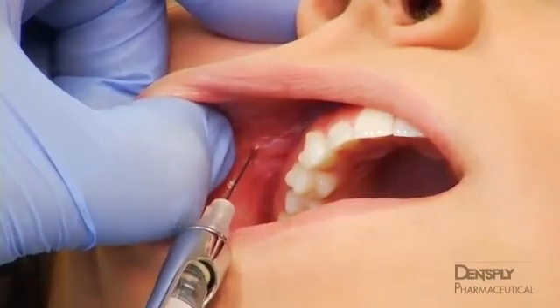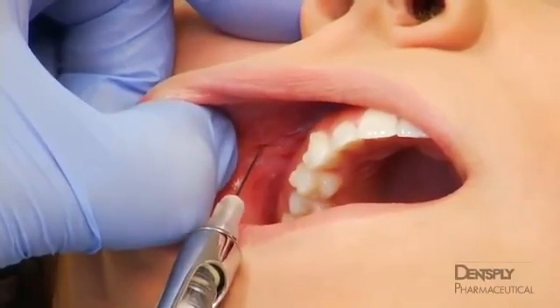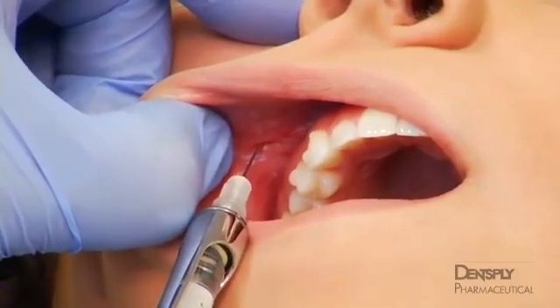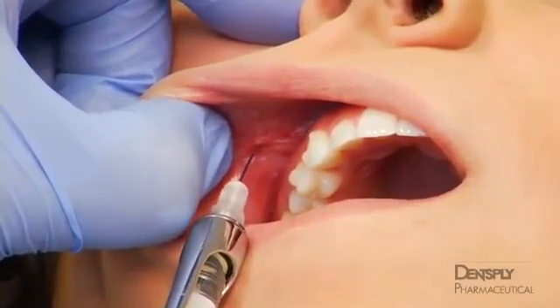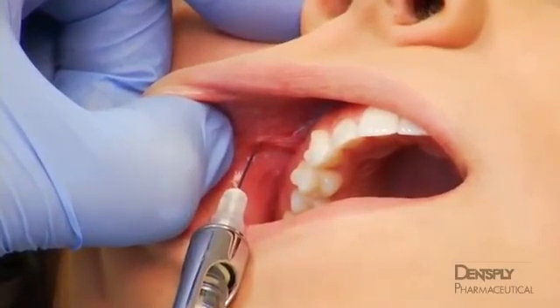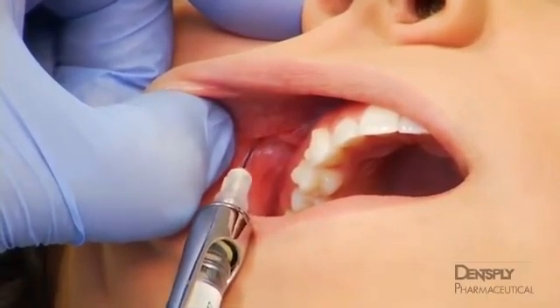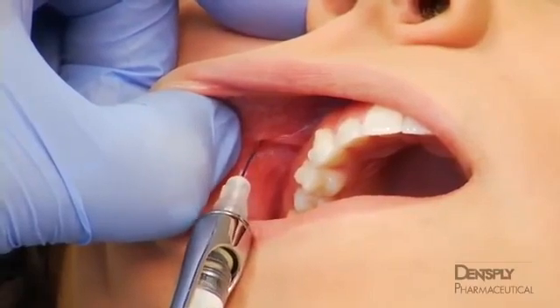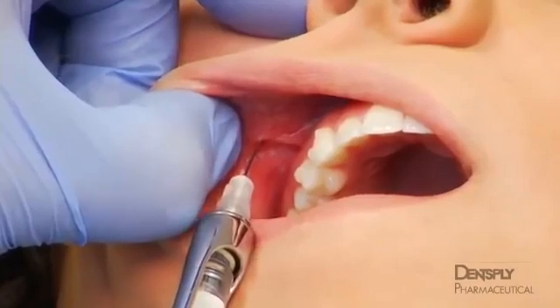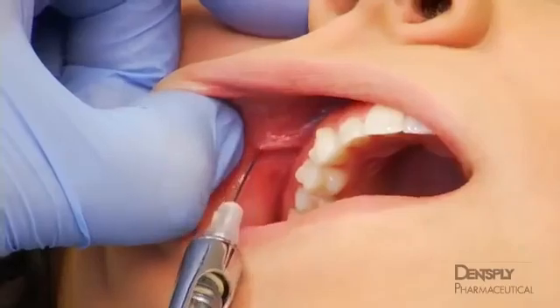For this and other injections described in this program, a few drops of anesthetic expressed as the needle is slowly advanced is useful to minimize discomfort. The average depth of penetration is about 15 millimeters. After negative aspiration, injection is made with a palpating finger remaining in place to help guide local anesthetic solution into the infraorbital canal. A total of 1 milliliter, or about 1/2 of a dental cartridge, is injected slowly. As with all other injections, the needle is then slowly withdrawn and recapped.